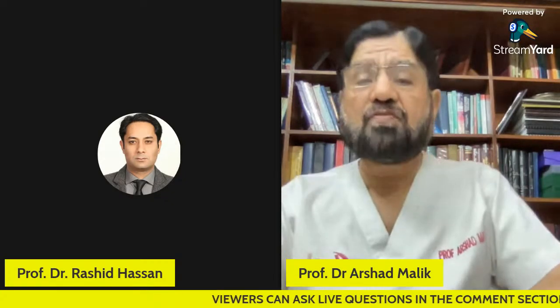Then we have the healing process. There are many studies that after getting a dry socket, you clean it and apply the soft laser, healing is promoted and epithelialization is improved. That is the miracle of the soft laser, that it gives prompt healing effects on wounds.